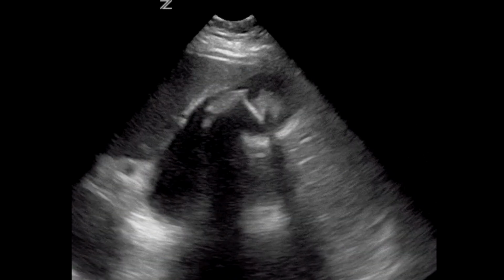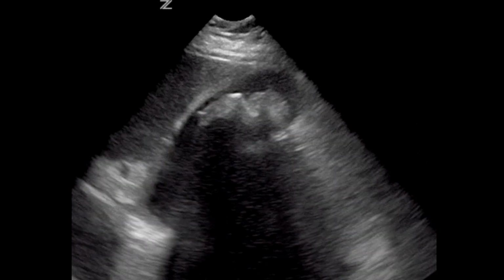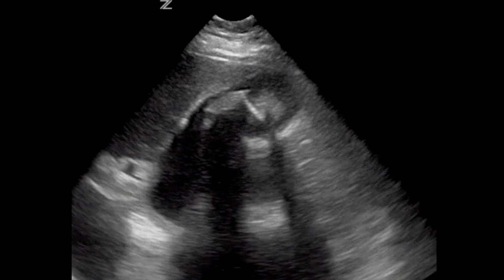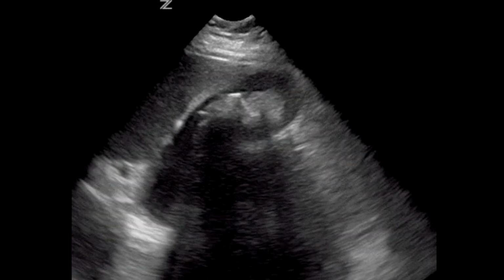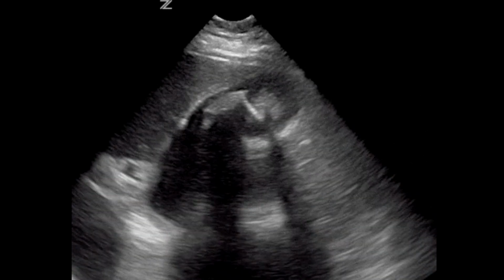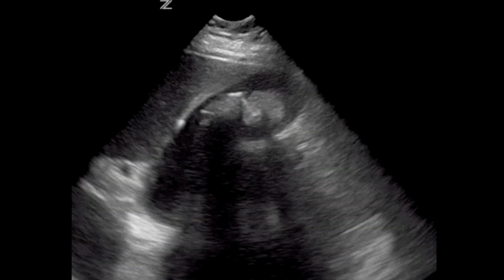Okay. So then your pancreatitis patient, this is useful information. Okay. Is there gallstones, yes or no? What's the cause of the pancreatitis? Was he drinking or does he have gallstones? So those are the two most common causes. And also, what does the gallbladder look like? Is it really inflamed? Is it angry? Or is it normal? That is useful information.